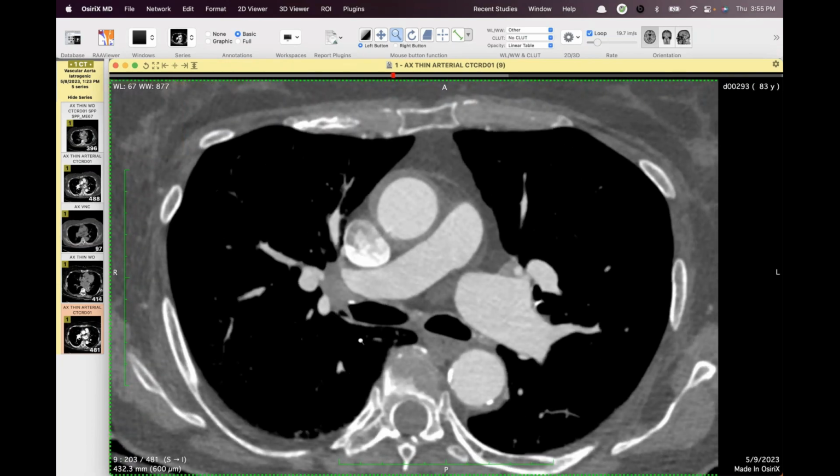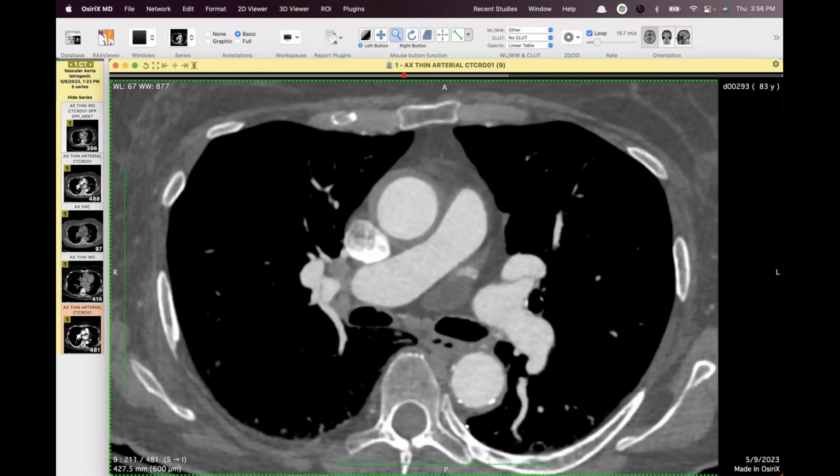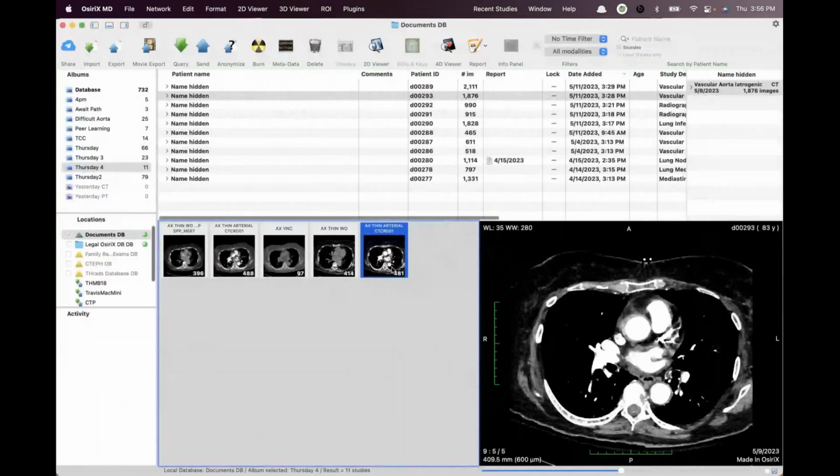I know the neuro folks do some dural venous fistula and CSF spinal leak stuff that they really need the ultra high resolution for. It's just getting a lot of weird artifacts. We're doing some of this stuff at 0.2. It's pretty cool for some things, but it's not really changing your diagnosis of UIP, is it? No, you can just see it's cooler. It just looks prettier.